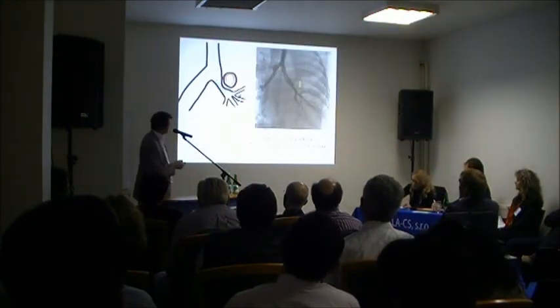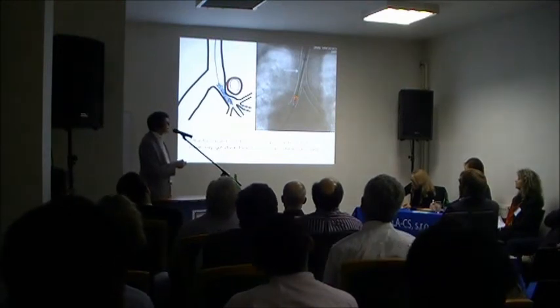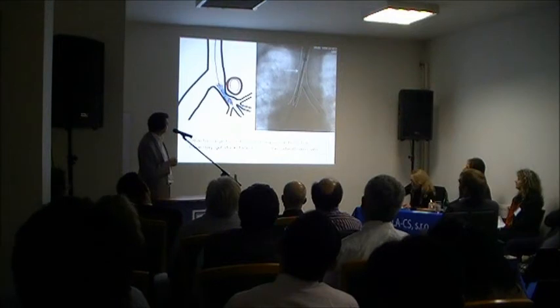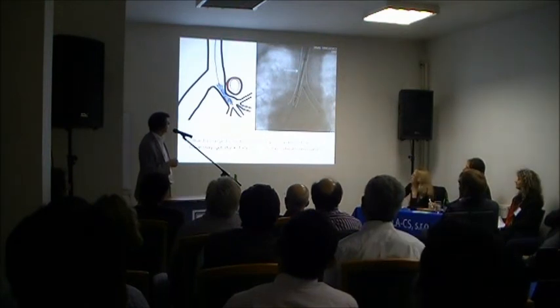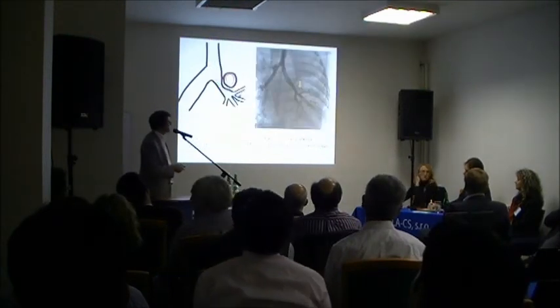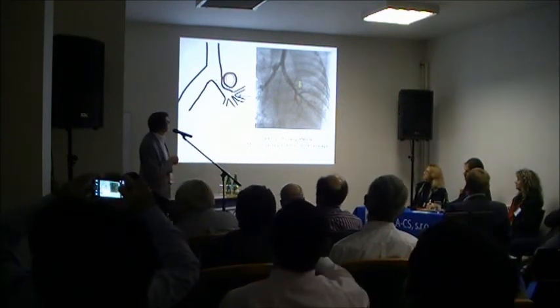The other option, just before I come there, is that the olive is quite far from the tip of where the stent is, and when we want to stent from bronchus to bronchus, we sometimes find this olive is too large to fit down here, because to align the stent perfectly, we have to have the olive positioned right over here, and we found that it doesn't fit in some children. So there is a technical problem with the length of the olive and its size relative to the bronchus in small little babies.